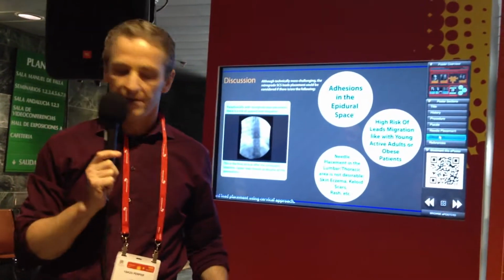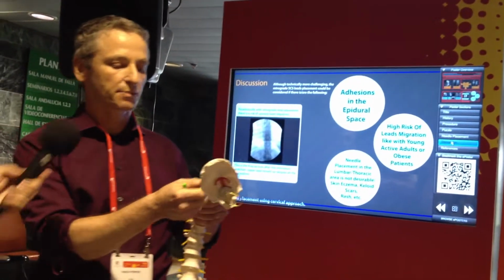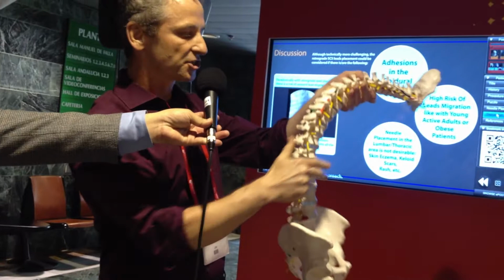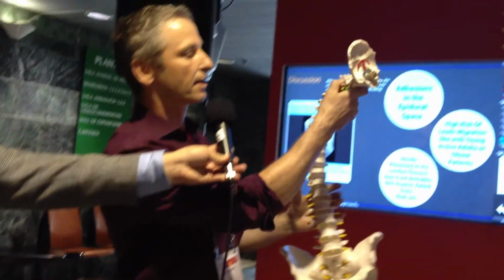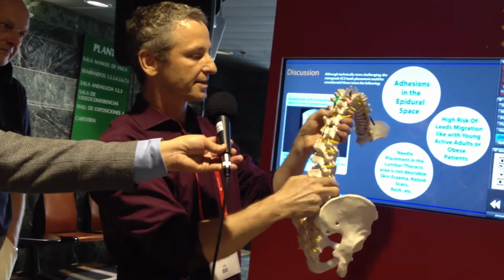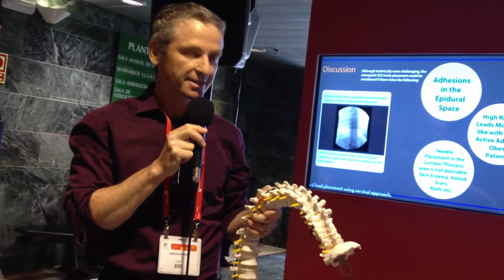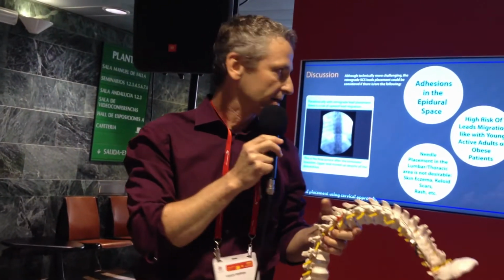We're going to employ poor Sam again. When a spinal cord stimulator is placed from the neck down, it's anchored above the target area. You can see it here. When it's placed traditionally from the lower back up, it's anchored below the target area. Now see the difference. When Sam bent his neck, he pulled the wire up this much. When he bent his lower back, he pulled the wire down this much. In other words, there is less risk of lead migration when the wire is placed through the neck than when it's placed traditionally through the lower back.